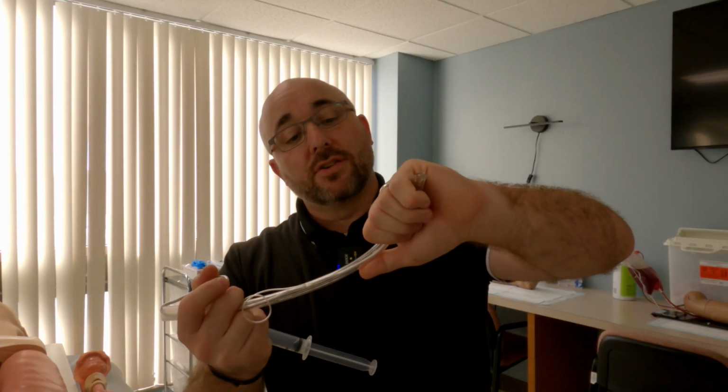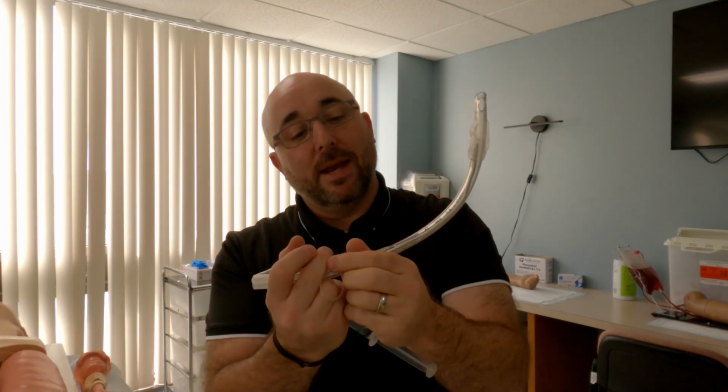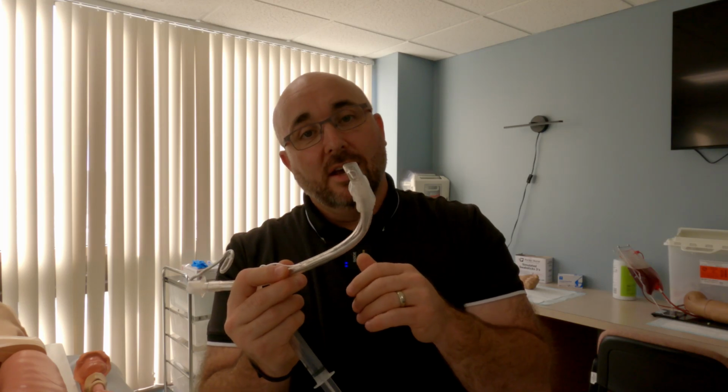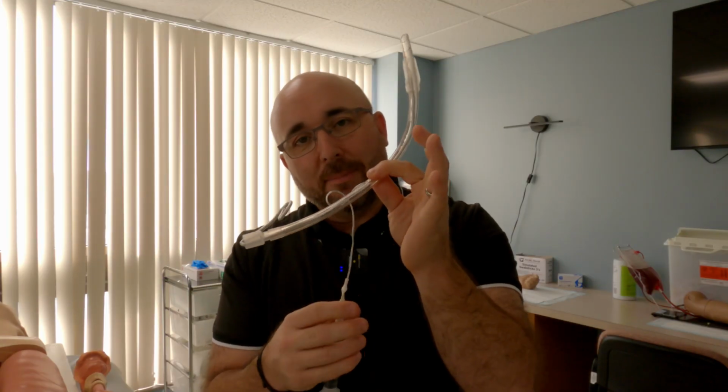So I pay real close attention when I'm setting this up. It's about half the tube down to make sure that that's not being touched, stays inside the bag. So we open the packaging up halfway. Leave this bottom half in if you can. Even leave it in there until you are ready to give it directly to the person that's intubating.